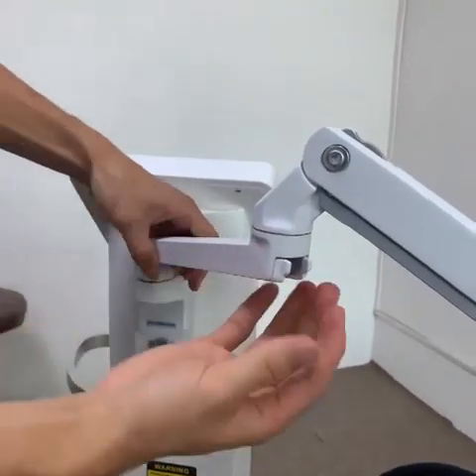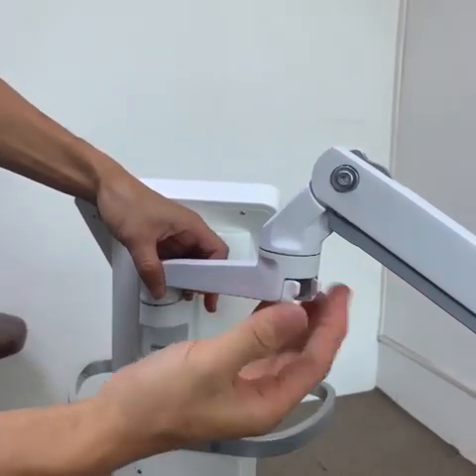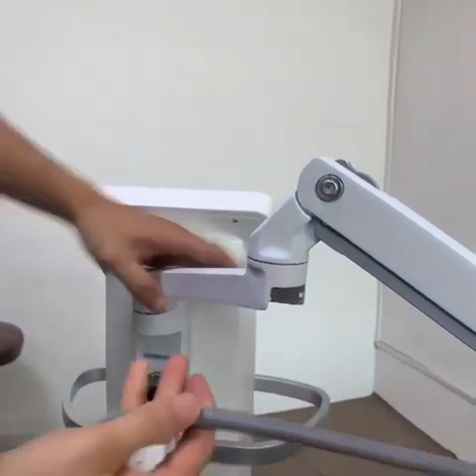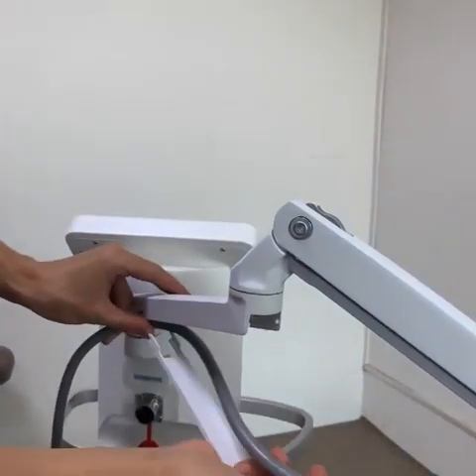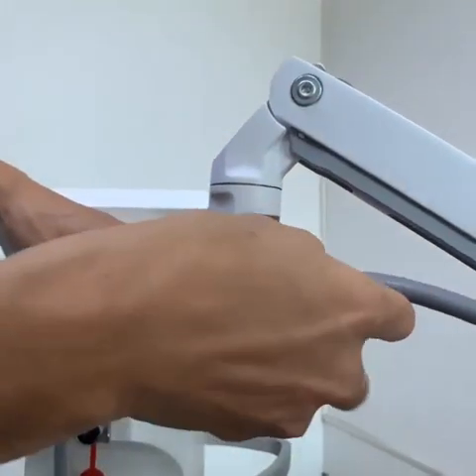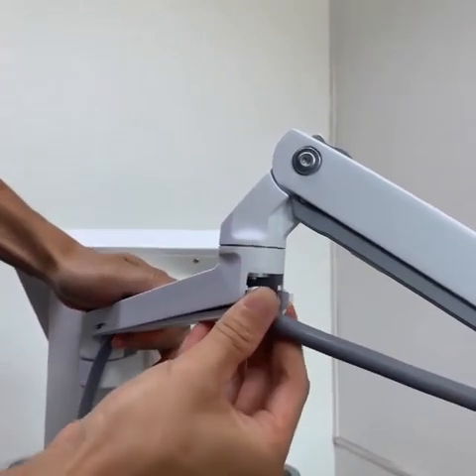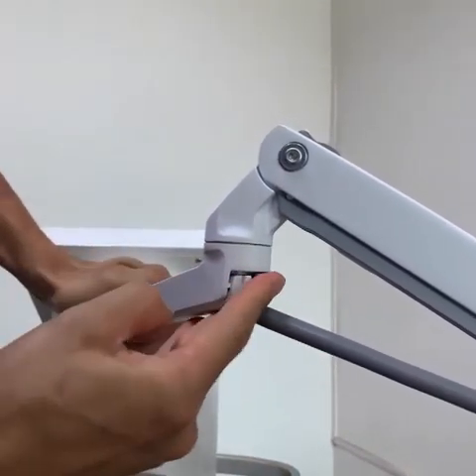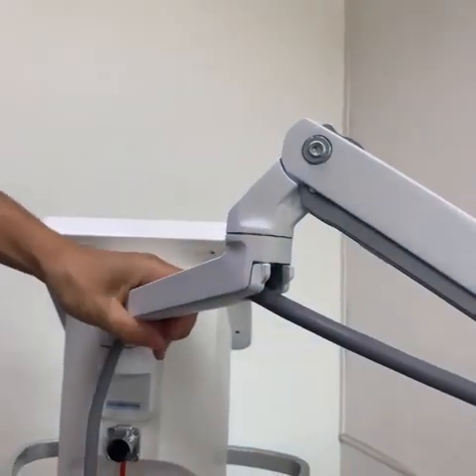Okay, next step, we should remove this sheet. Please press first and then remove. And then tighten this cable to the correct position. You can adjust by yourself. Please make it tighten.